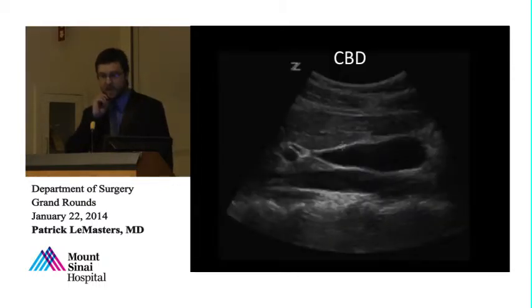So what about looking for the common bile duct? This is actually often difficult to examine, and I find it very difficult to find. The best way I found is you get a longitudinal view of the gallbladder, and you get the portal vein right behind it, and so it almost forms an exclamation point. In this view, you can scan back and forth, and you can look for the 2 bright hyperechoic walls of the common bile duct. And here's a nice place for you to identify it and be able to measure it at this point.